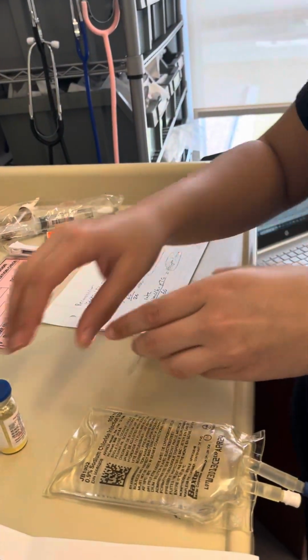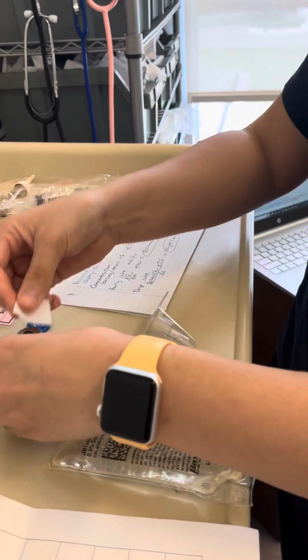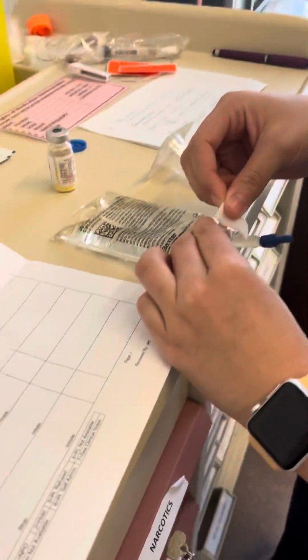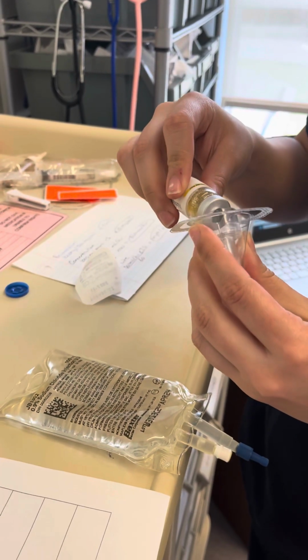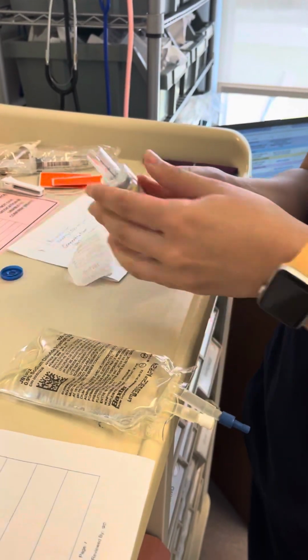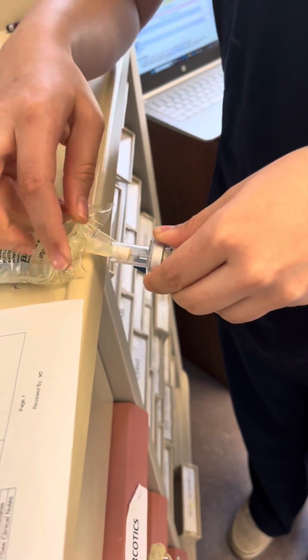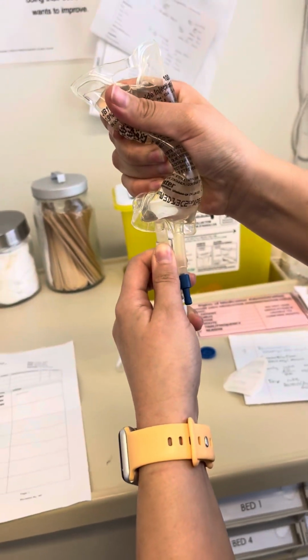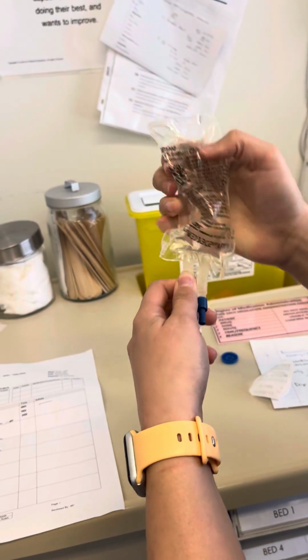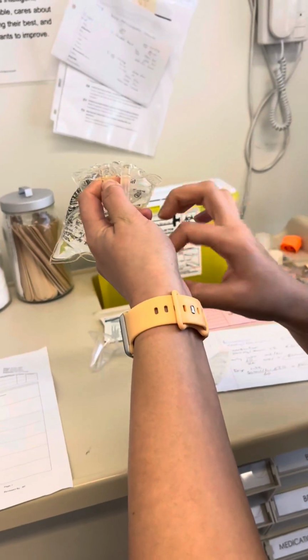Okay, so let's take this off. Swab this 15-30 seconds, swab this 15-30 seconds. We'll get our reconstitution device. Okay, we'll give this a good shake. Make sure there's no lumps, clumps.